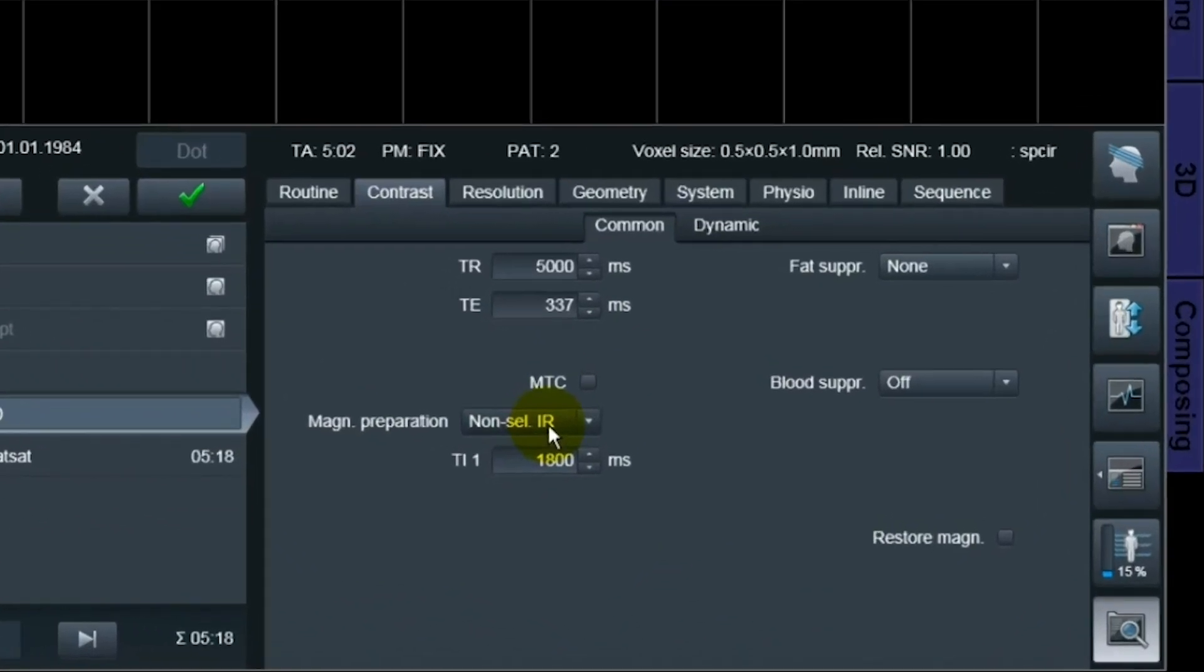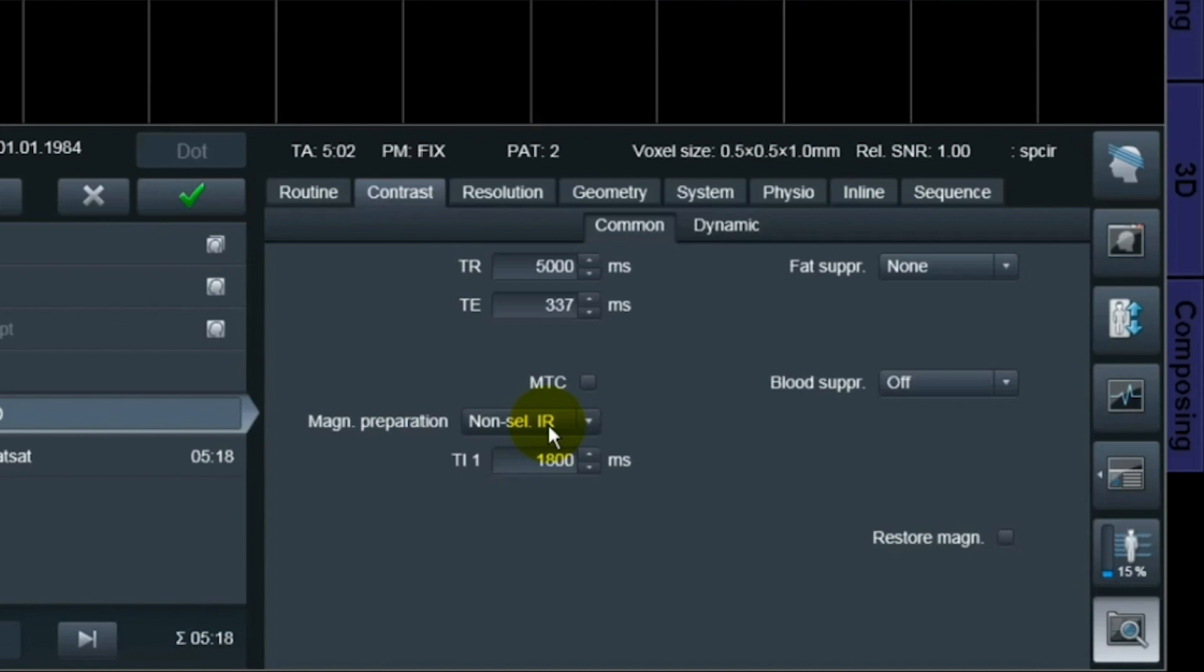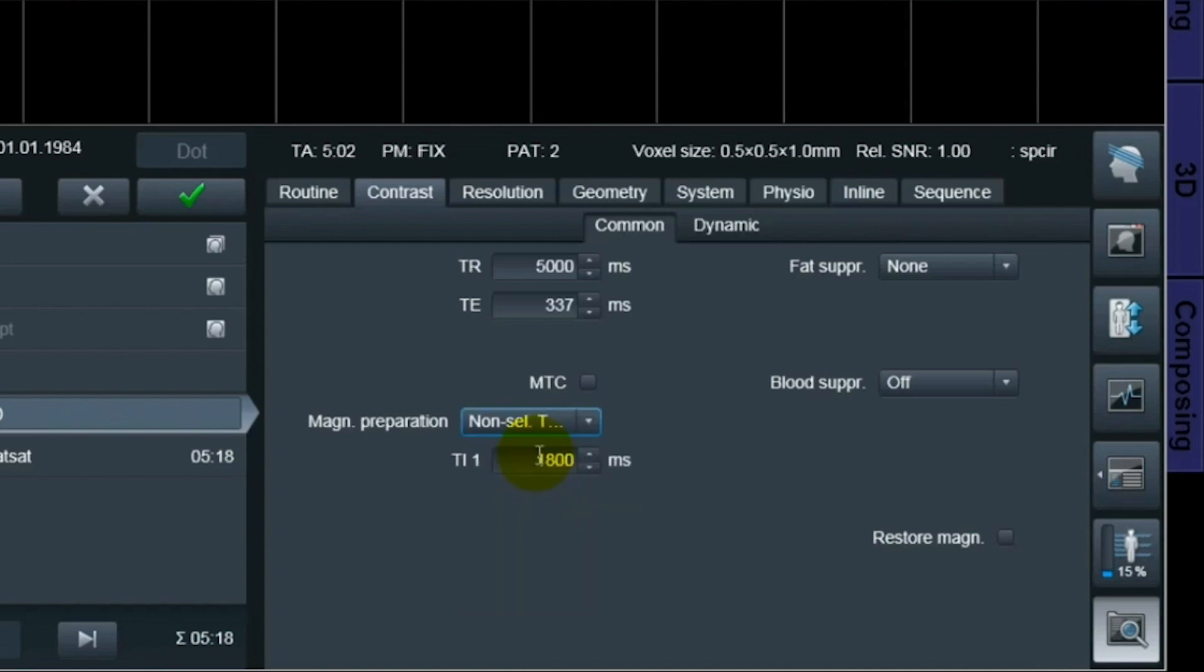Right here now it's another sequence open, it's optimized like the old software with the TR which is lower, around 5000, and then it only has a pulse which is non-selective T2 inversion recovery, which is like in the old software, and then the TI time is adjusted accordingly to that to 1800.